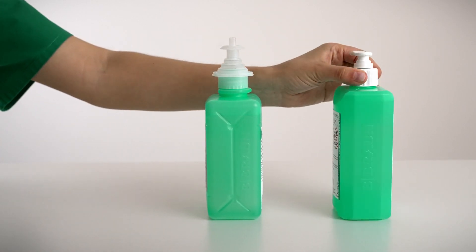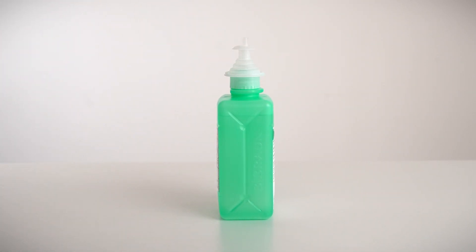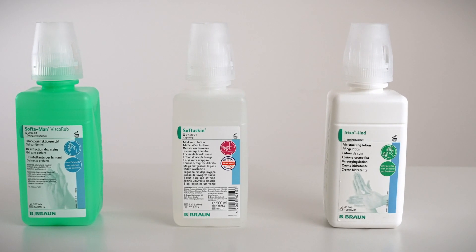The Automatic Dispenser is made for our hand hygiene range, which consists of hand disinfection, hand wash, and hand care products.